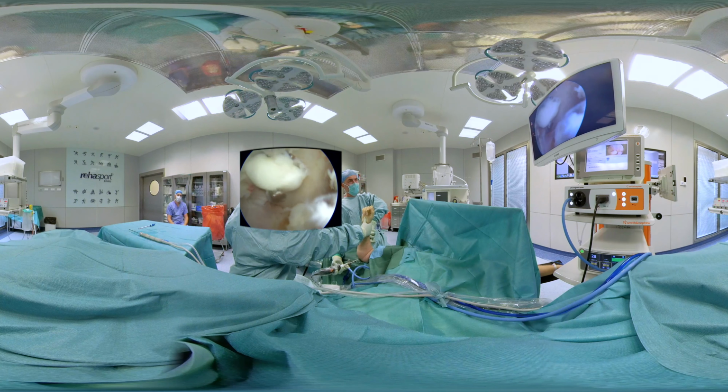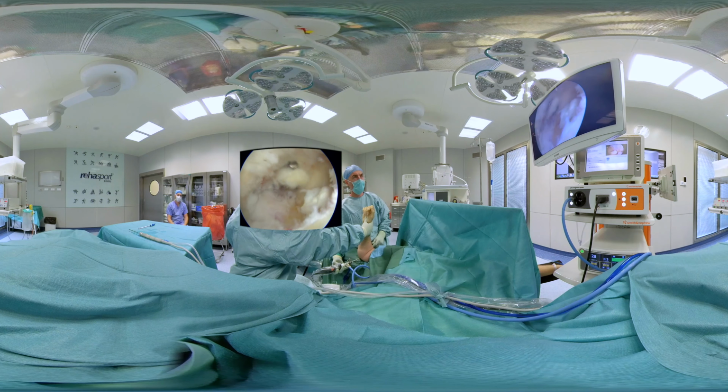Remaining loose bodies are removed. All parts of the joint have to be explored in search of them.